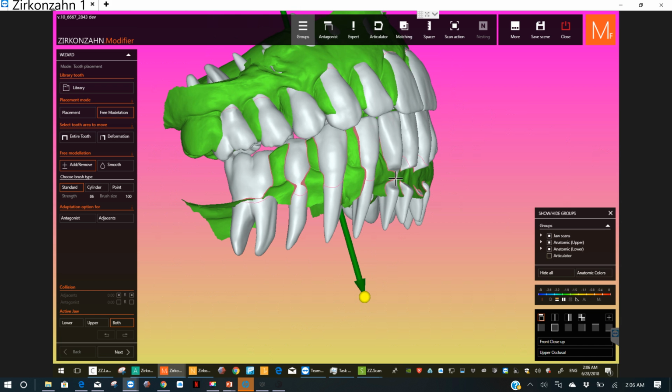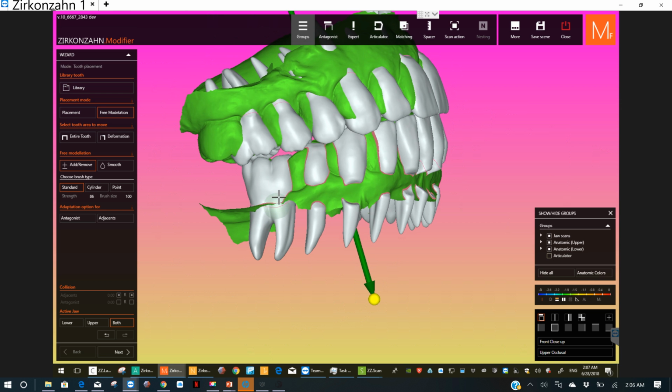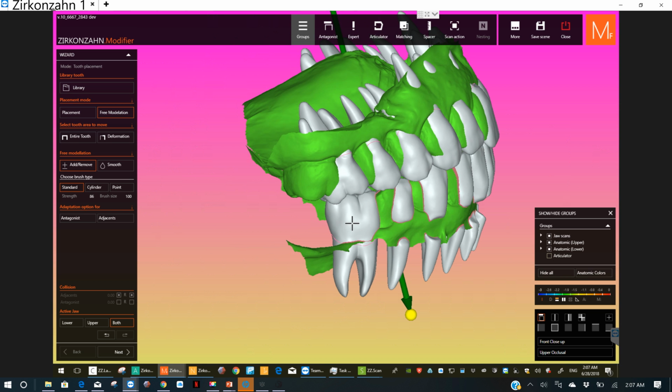Usually supporting the lower lip right there is not necessarily a good thing. It makes their lower lip stick out, so maybe I got a little overzealous on my initial design of those. Took them out too far. So I'm going to try to blend that in. And there's an extra tooth right there. That's nice. You can start getting used to having a tooth.